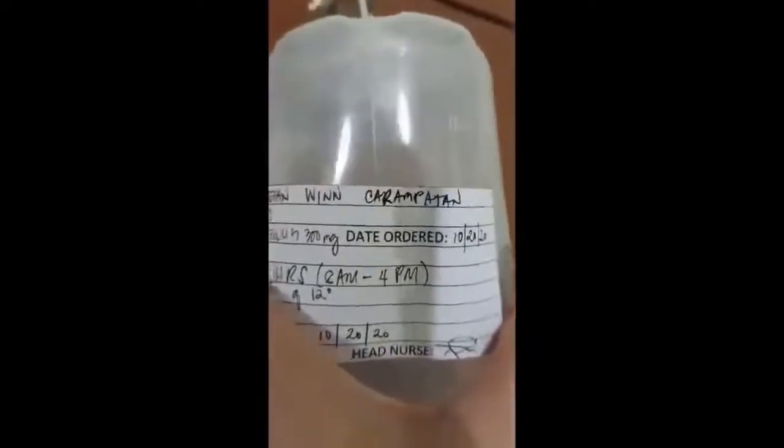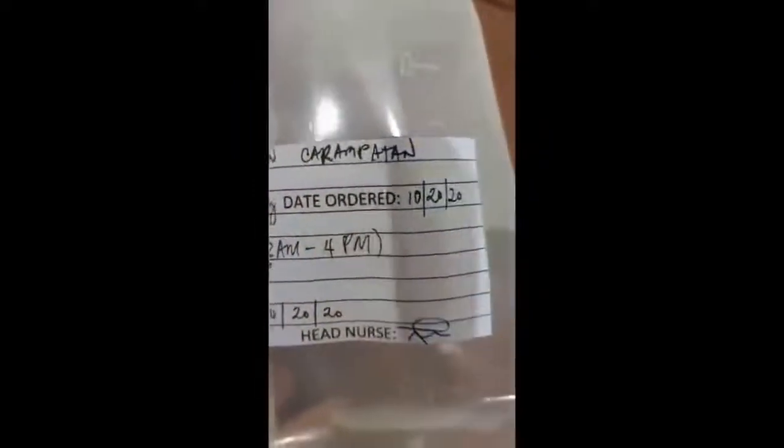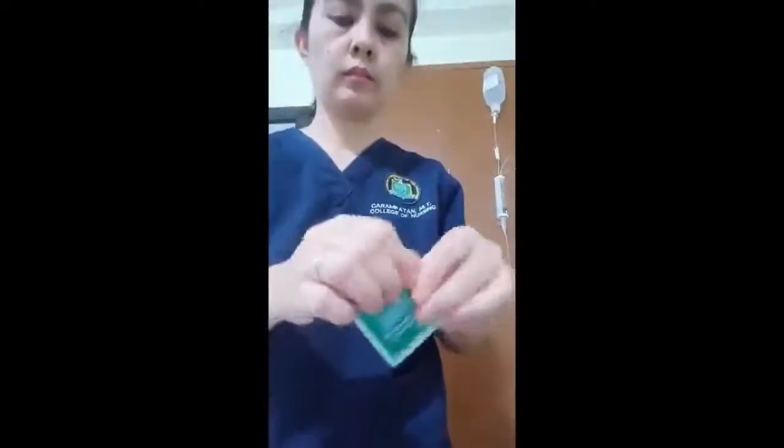For the incorporation of medication into the Soluset, first make a medication card that provides pertinent information: the name of the patient, the number, the date ordered, medication, the dosage, and time of administration. It also has the attending physician and the signature of the nurse. Aspirate the prepared right drug with the correct dose, so it prepares the medication for administration.